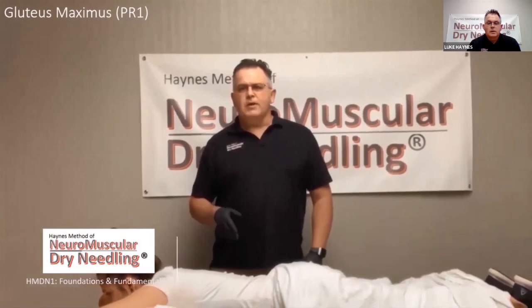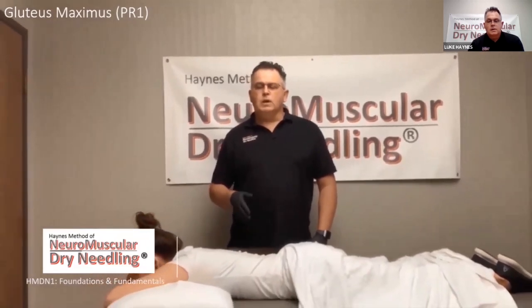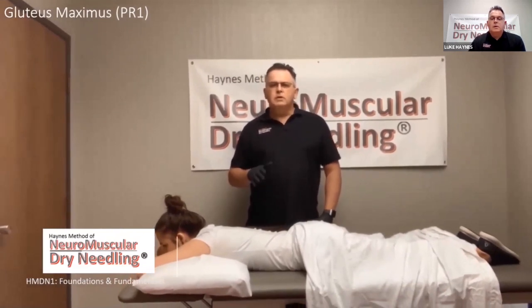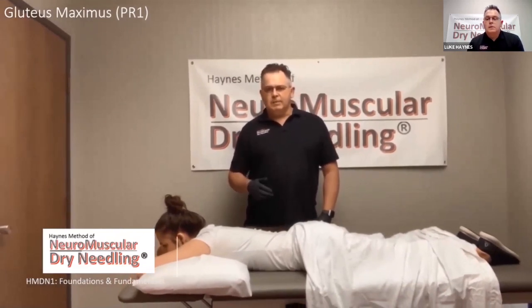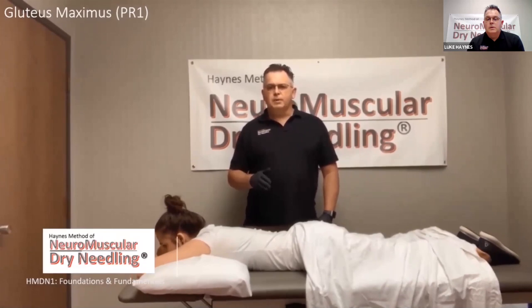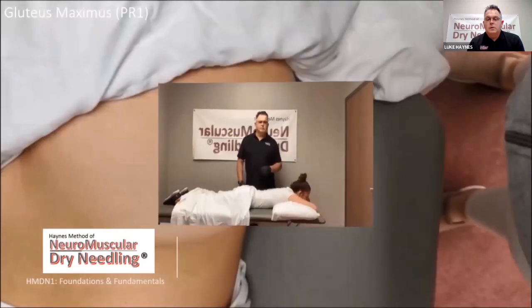For the gluteus maximus, the patient is going to be in the prone position. The needle length here will be 40 to 60 plus millimeters. The backdrop is going to be on the ilium. We're going to locate a midpoint between the PSIS and the superior aspect of the greater trochanter. We're going to needle posterior to anterior with relative orientation to the ilium, using the ilium as a bony backdrop. Caution here for the sciatic nerve. Proper angulation of the needle perpendicular to the ilium will place the needle superior to the sciatic nerve. And now we're good.